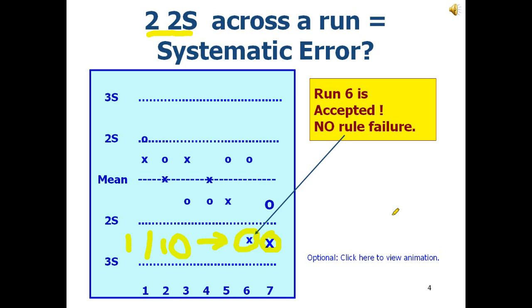How many of you remember the story about the boy and the wolf? Well, that's what this is. More often than not, that X is there, and it's crying wolf, and there's no wolf. Now, it does present a problem. The whole thing is not perfect. It is possible that there's a problem, and you don't accept that until run 7. So you do have to deal, in that case, with what the results went out on run 6. It is not, period, cost-effective to freak on run 6, period.